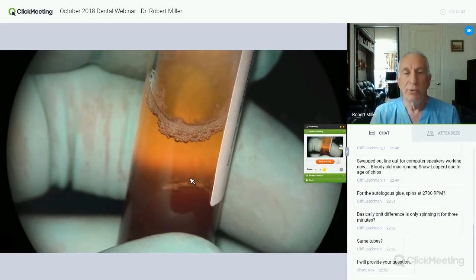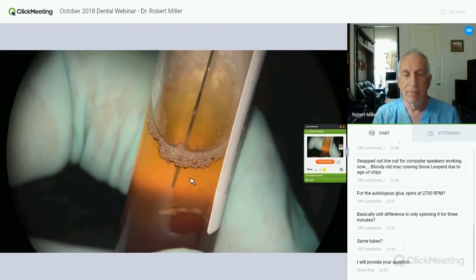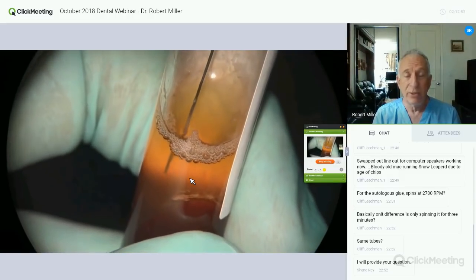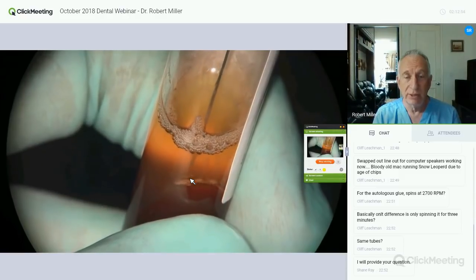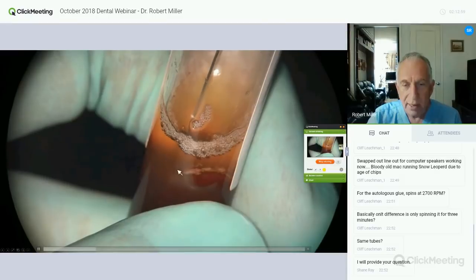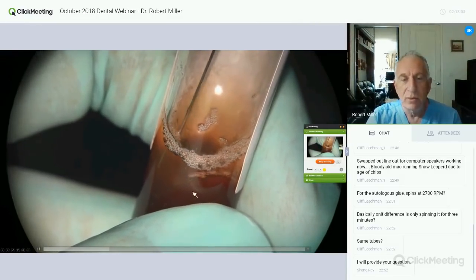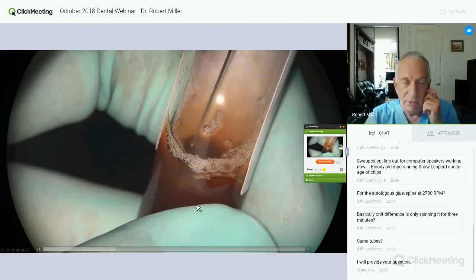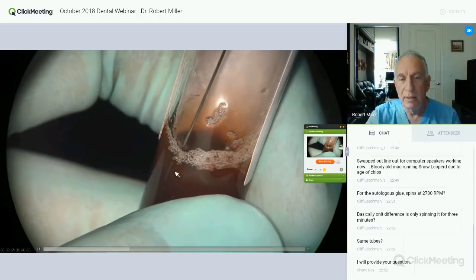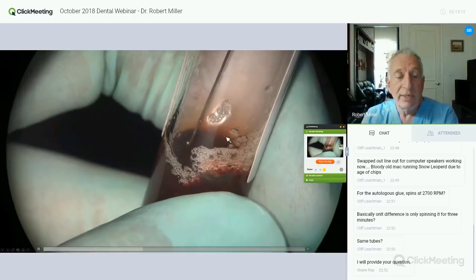So we're going to make it super bioactive by taking some of this autologous plasma. For the PRF users, it's a white tube, so it only spins for 3 minutes. We have the tip of the needle right down in the brighter red area. The brighter red area has a preponderance of platelets, not going down into the deep red, which are erythrocytes. We don't want those, but we certainly want the brighter red, which are the platelets.